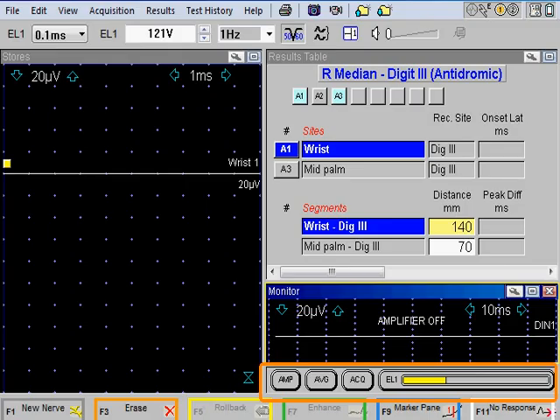When I stop changing the intensity, the panel is displayed in its default configuration. The stimulus intensity is indicated using a sliding bar. The yellow highlight indicates the stimulus level. When it reaches all the way to the right end, that would indicate 100% or the maximum possible stimulation is being delivered.